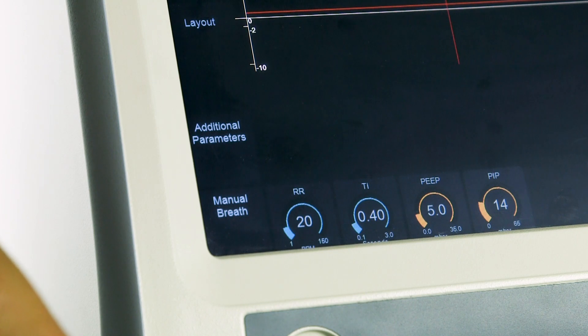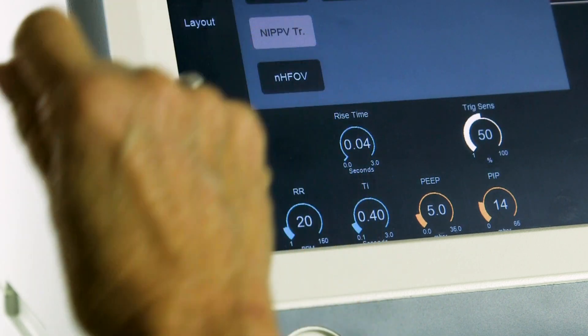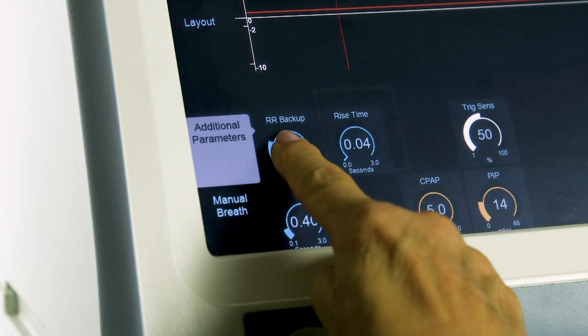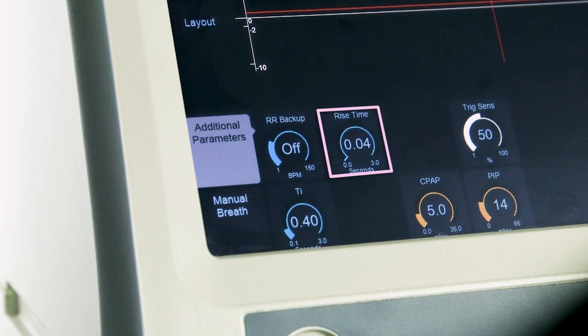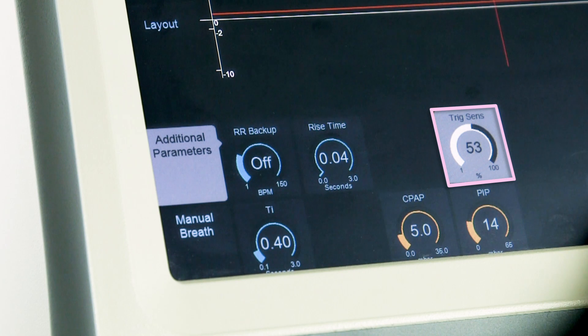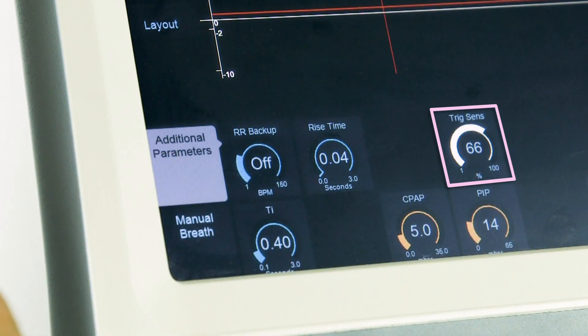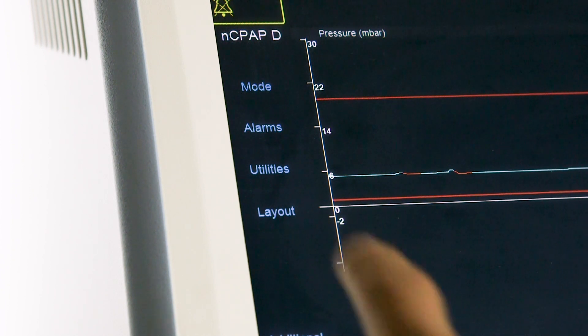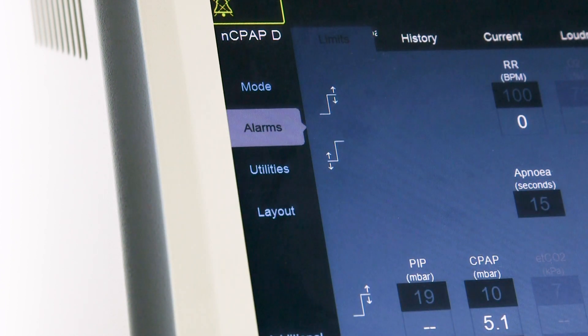The user can also set additional parameters which are displayed when the mode is first selected. RR backup: push and hold to enable or disable — the default condition is off. Rise time: the time to reach the PIP for manual or backup breaths. Trigger sensitivity, which adjusts the threshold for breath detection — the effort required by the patient for the ventilator to recognize the breath. The higher the number, the greater the sensitivity to detect small breaths. The ventilator automatically sets alarm limits around the set values, which the operator can amend in the alarm panel.